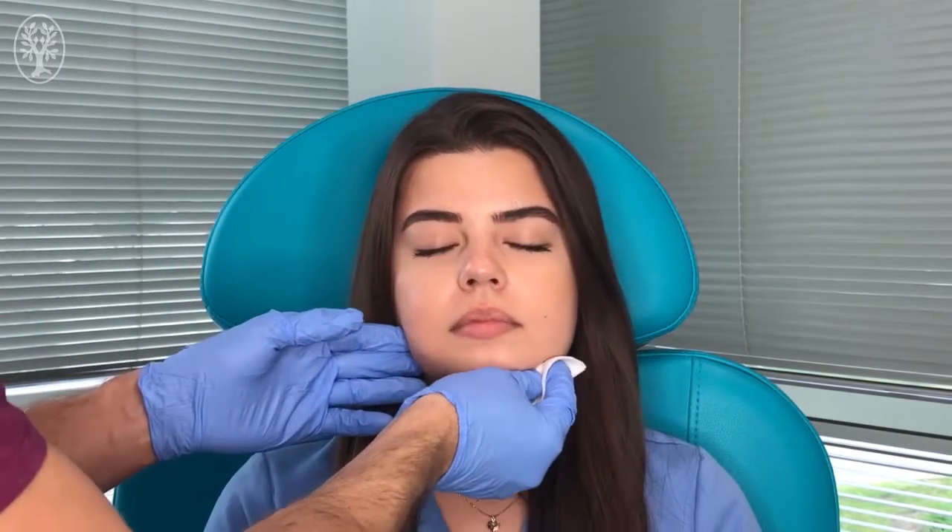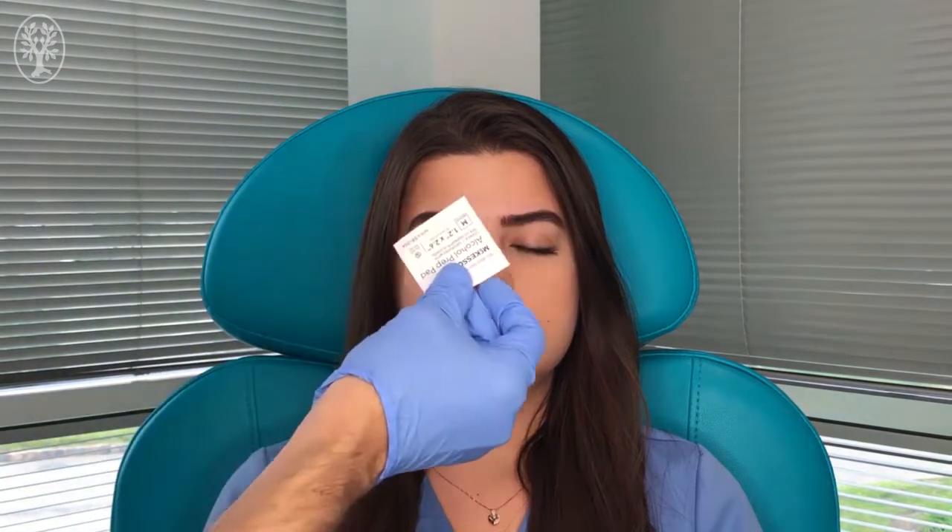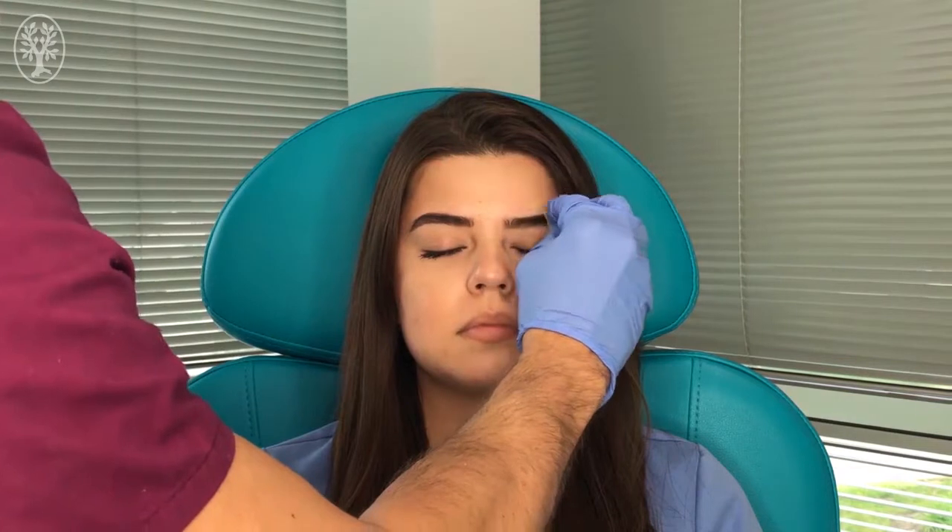Now close your eyes. We're going to remove the excess topical anesthesia. Then we are going to clean the area of the injection with a little bit of alcohol to keep the area sterile.